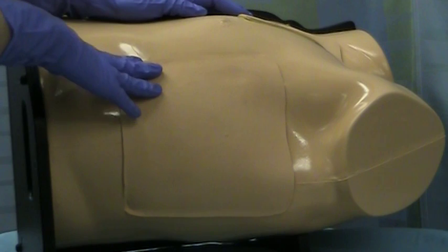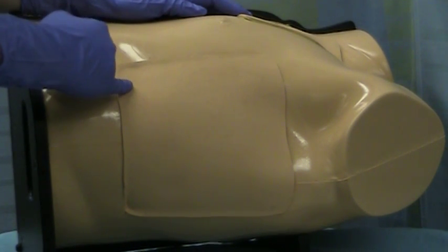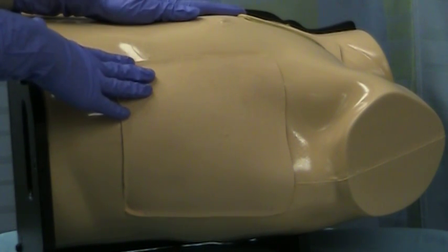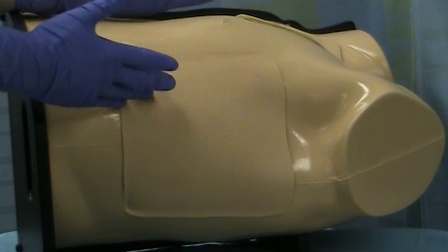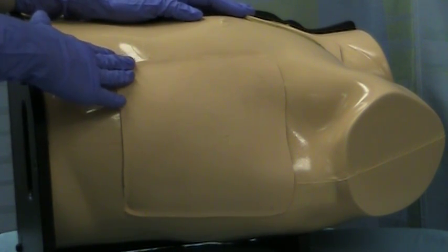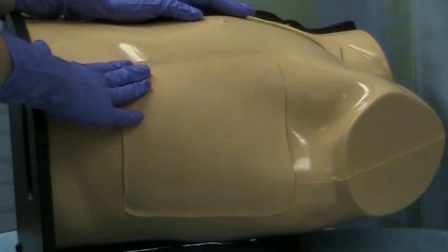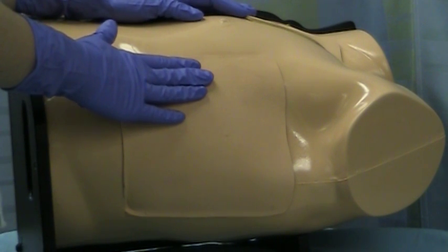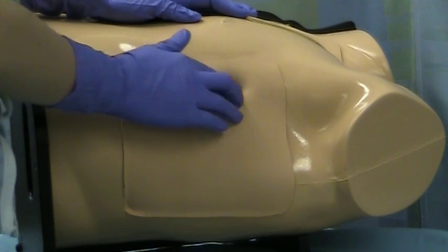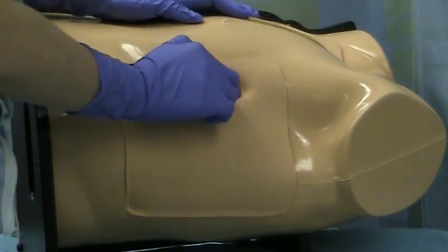This is done under sterile technique with the patient anesthetized on the skin using lidocaine, and then hopefully we've used a systemic relaxant and pain medication as well if the patient is awake and alert and talking to us. So we would go ahead and sterilize the skin with a prep, anesthetize it using lidocaine, and then go ahead and make our incision. An important thing in finding our landmarks for incision is to be able to feel the ribs, which on some patients can be more difficult than others.